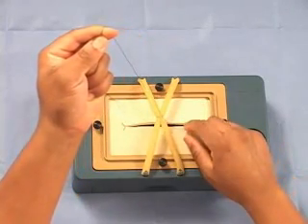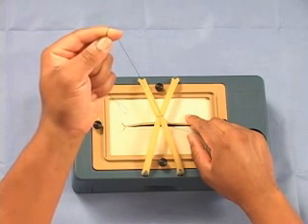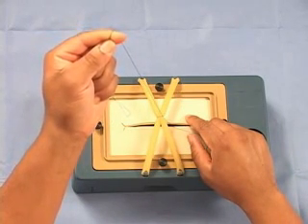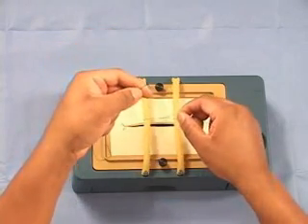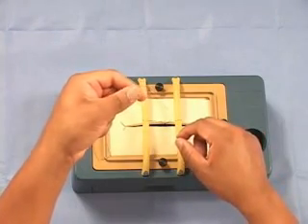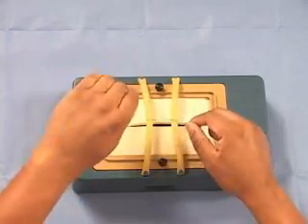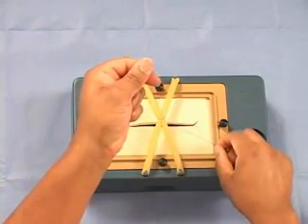Now, let's identify which hand we should pull up with. If I pull up with my left hand or posting hand, notice that the knot stays in place. If I pull up with the other hand, notice that the knot has become unraveled. So, maintain your tension with your posting hand. I am currently pushing with my index finger.